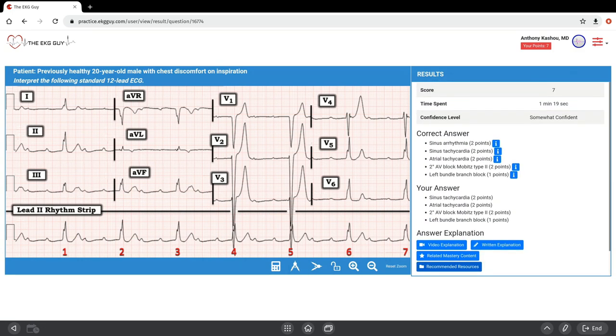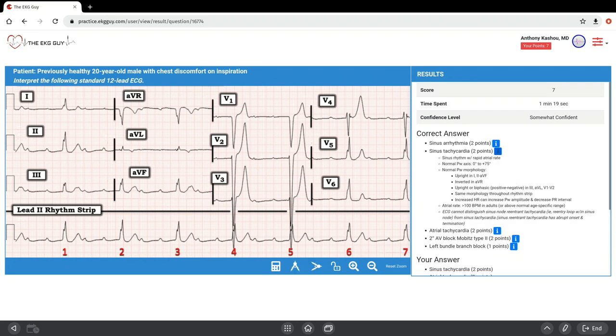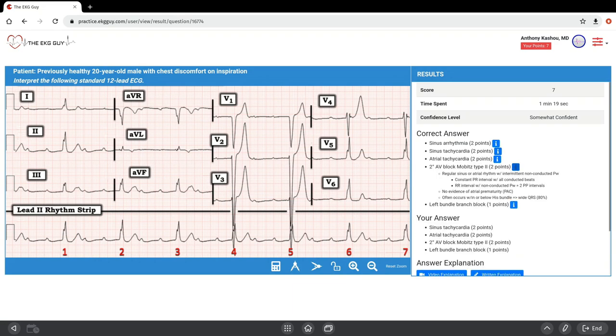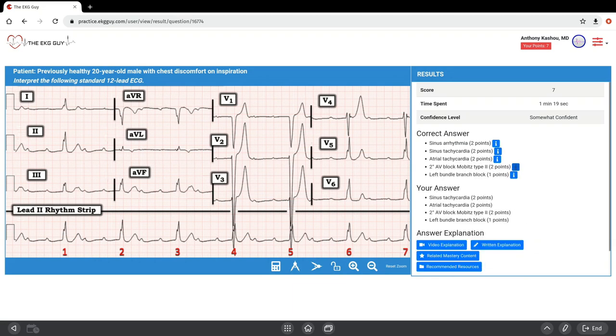Let's go through this answer. The other thing to note is if you're not sure what sinus tachycardia is, you can click it and it gives you that description. Let's go through this ECG together now.